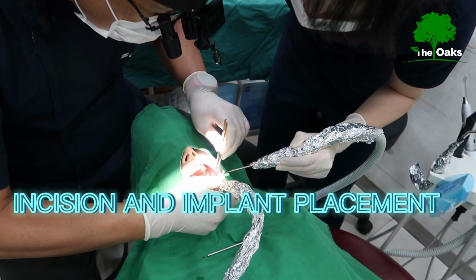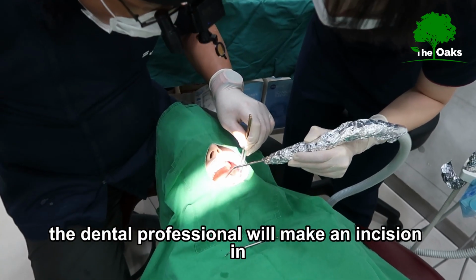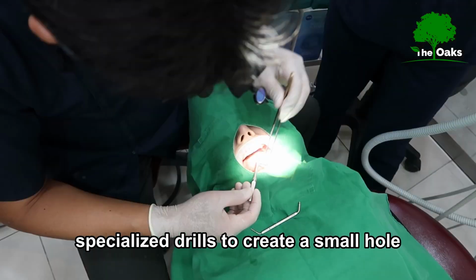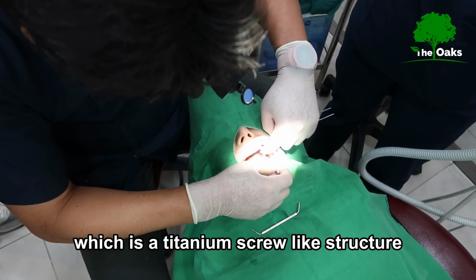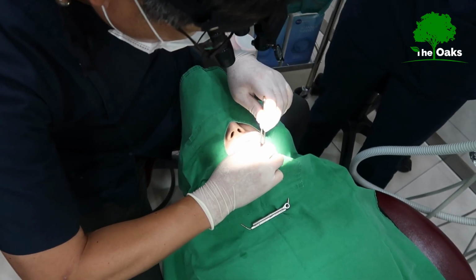Incision and implant placement. Once the anesthesia has taken effect, the dental professional will make an incision in the gum tissue to expose the jawbone. They will then use specialized drills to create a small hole or socket in the bone for each implant. The dental implant, which is a titanium screw-like structure, is carefully placed into the prepared socket.